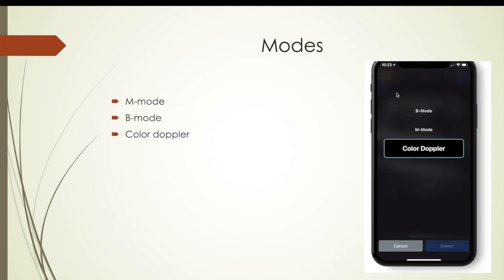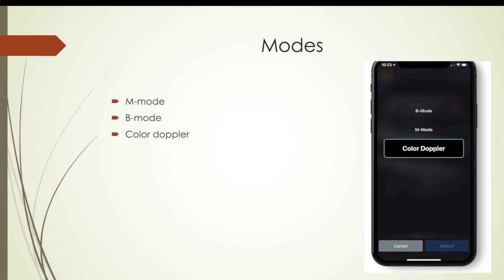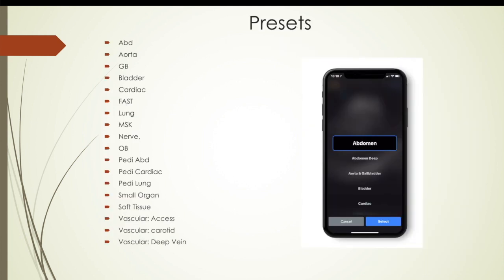It has M-mode, B-mode, and color Doppler. With one hand while using the probe, you can literally do a simple swipe of the thumb and a tap to change modes. It does all the various measurements and calculations — linear, ellipse — and you can put labels on it. I mentioned the bladder volume auto-calculation. The presets are also just a simple swipe and tap to change, making it very convenient.